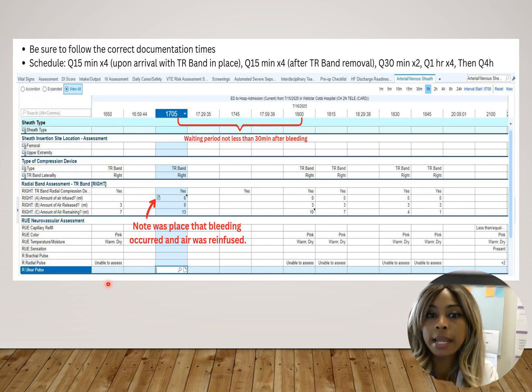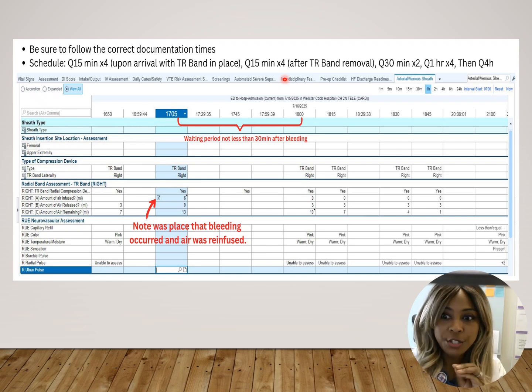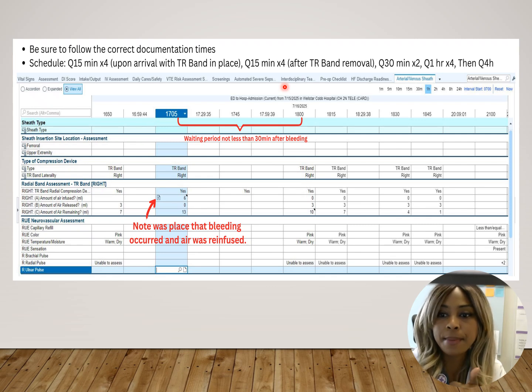And if we were able to scroll over on here, we would see the rest of this documentation, so that's good. So I can't state enough, once you've read those physician orders, follow those physician orders to a T. We cannot go wrong if we're following those orders. And then notifying the physician for anything that they need to be notified about, spasms, extra bleeding that we cannot control, those types of things. And that is actually it. Let's go to the next screen.